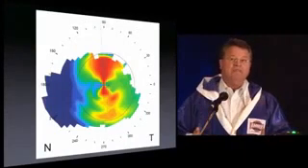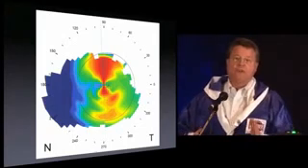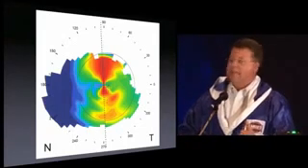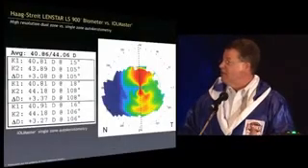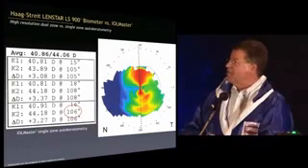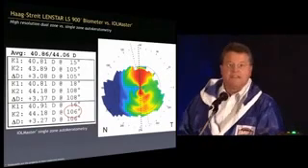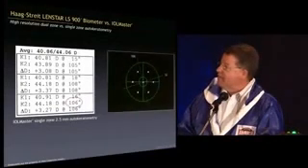Well, plan B for figuring out the axis is you can take an axial map, draw a line straight through the 2 lobes, and by definition, that's the steep axis. It can't be anything else. So here's the IOLMaster. We'll say 106 degrees. Well, look at where 106 degrees is. That's in another zip code. That's not right.